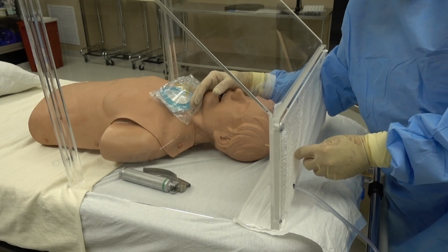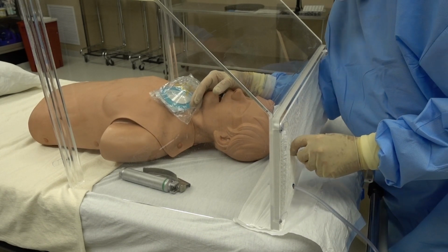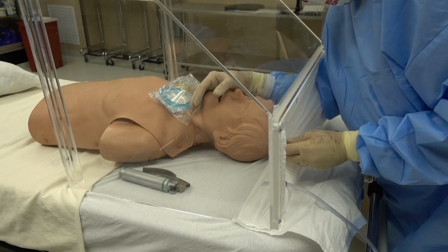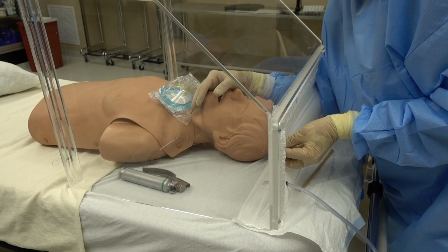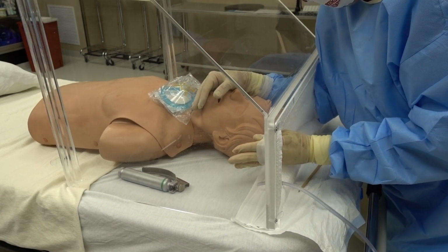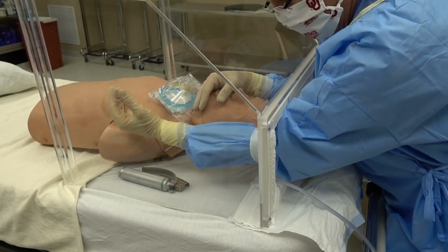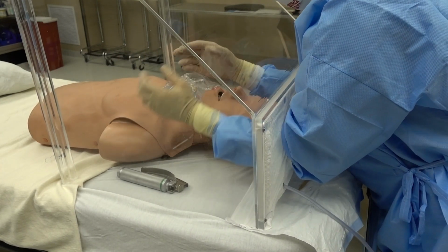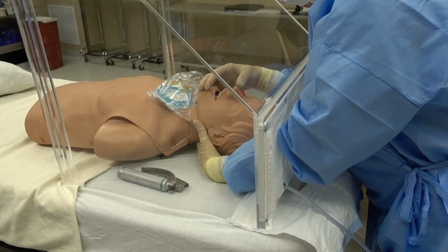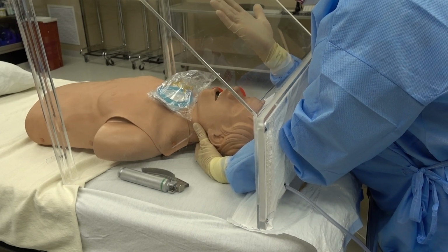But you can pull this out, and you're already under negative vacuum with this on. And you find it with your finger, start going through, and you just wiggle in there. And you don't have to worry about it tearing. You got 2 membranes on you. You go all the way up to your elbow. And again, you can see you could operate in here. We think we're going to be able to do tonsils and things in here. We've got a 45-degree angle on this.